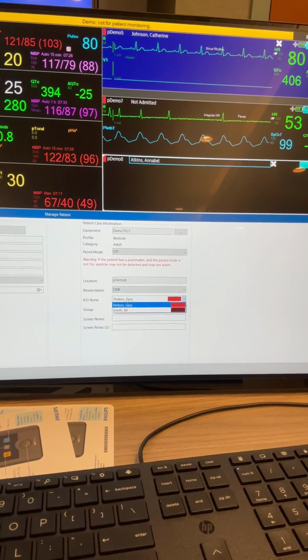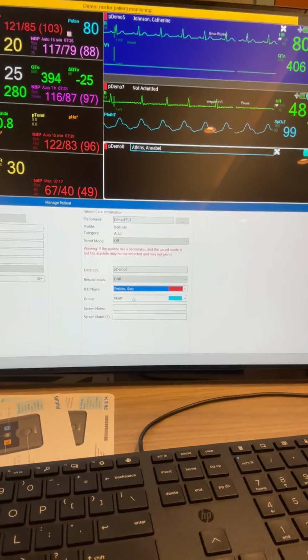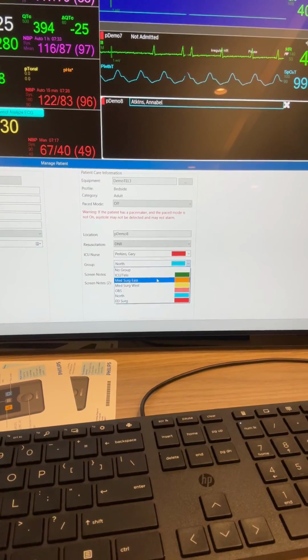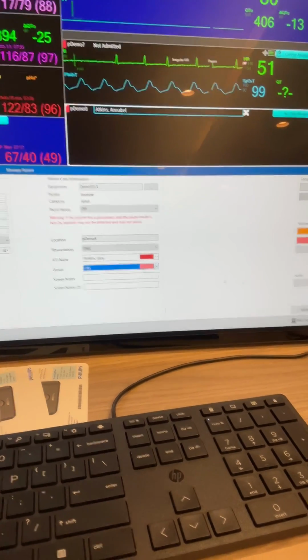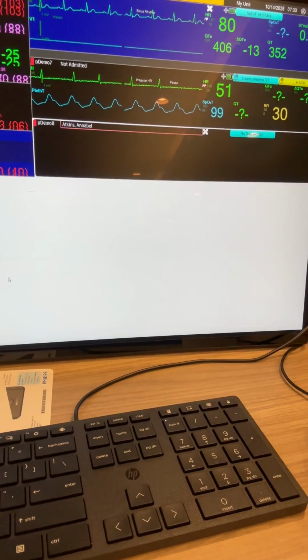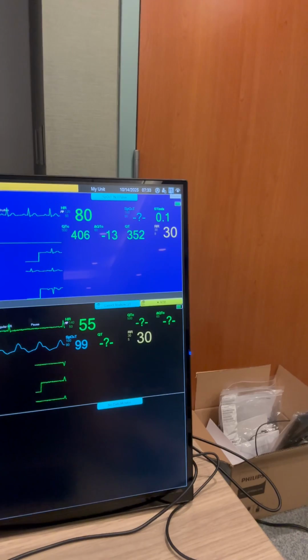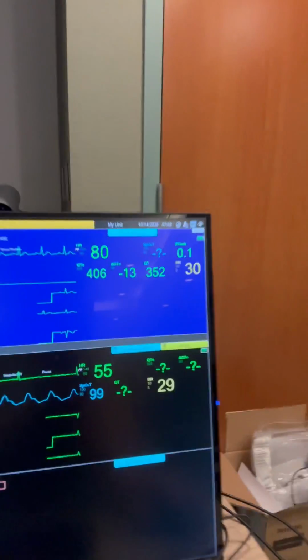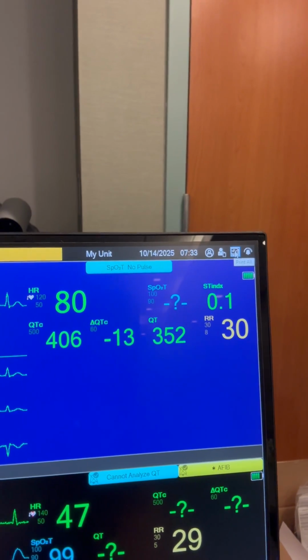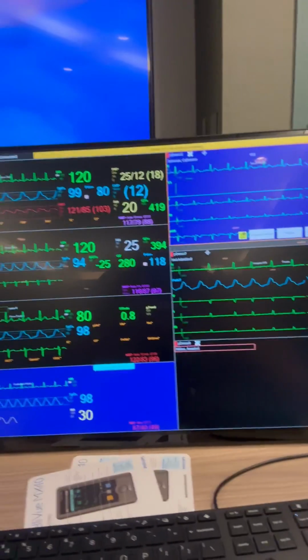The ICU nurse won't be in there, but which department they're in, like ours. And then when you have to put them on a telepack, we will be choosing which color again for it to go in. Then you hit apply. From the central monitors, the button that you need to print all is where every single patient's telemetry strip will be printed out. So you have that option.